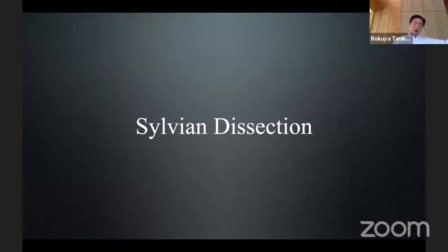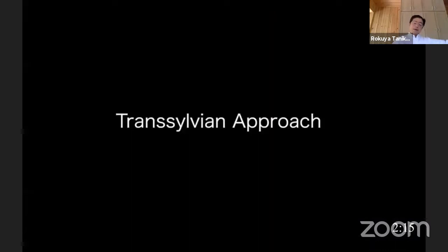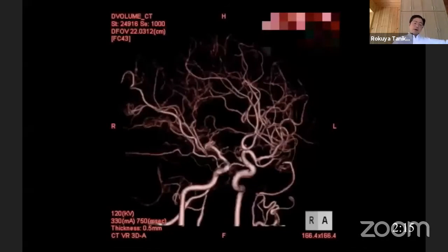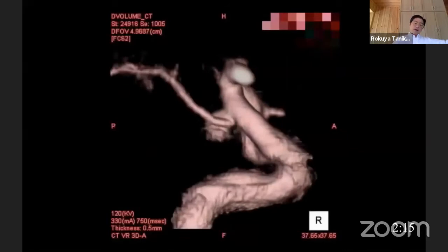The most fundamental approach in neurosurgery is sylvian dissection — the so-called trans-sylvian approach. This is an example of a trans-sylvian approach for a small left PCOM unruptured aneurysm. You can see the PCOM is arising from the medial neck of the aneurysm. This is a left-side fronto-temporal craniotomy. In between multiple superficial sylvian veins, I am beginning the arachnoid incision.